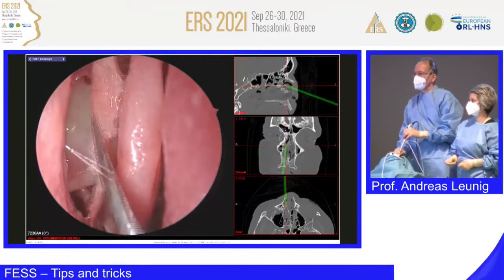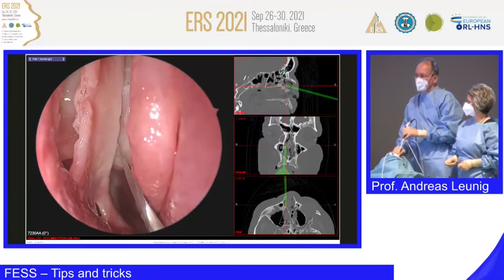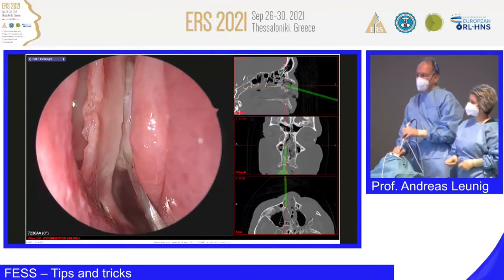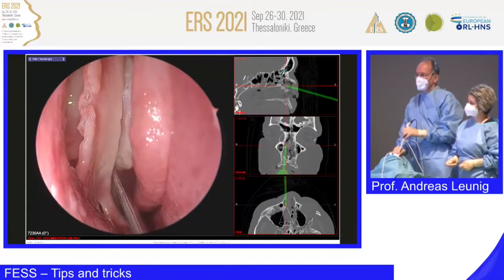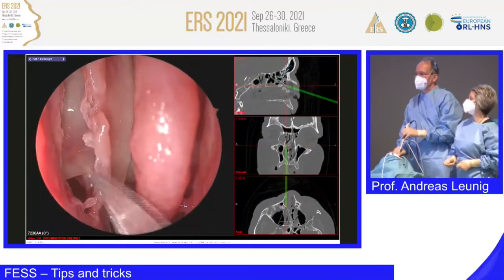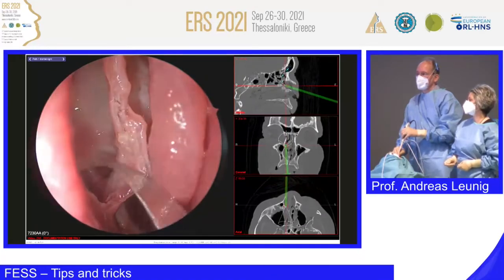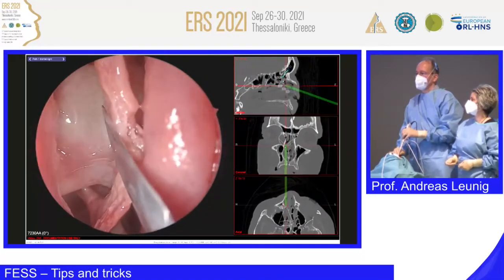And the way here through this corner, this is the hiatus semilunaris, this is this space, and this is the infundibulum ethmoidale, and here that's the natural ostium of the maxillary sinus. And this here is the ethmoidal bulla.